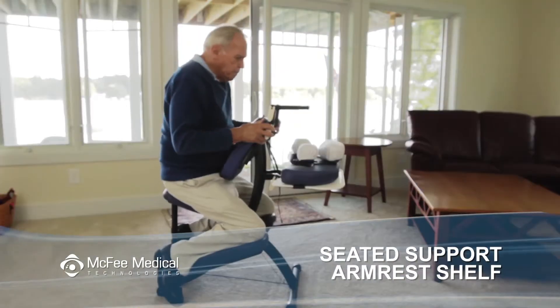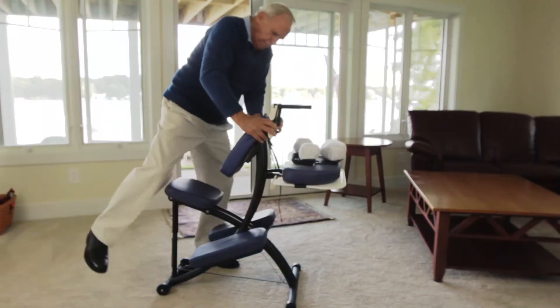To get off the chair, use the chest pad to brace your hands and push yourself up. Do not use the armrest for this purpose.